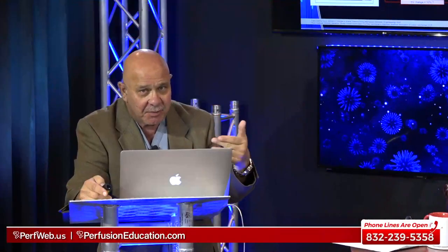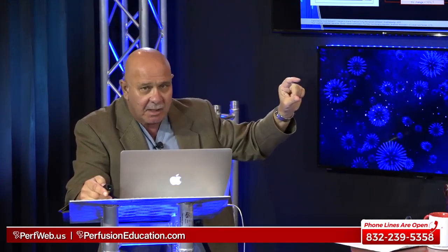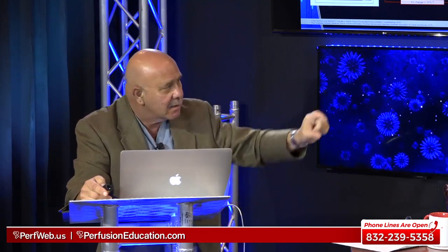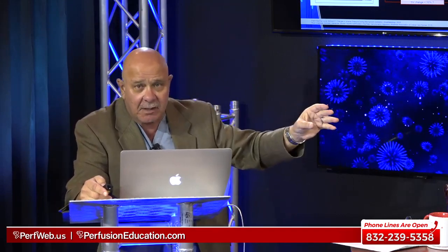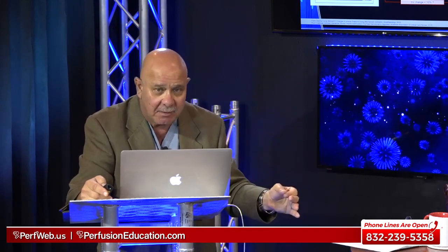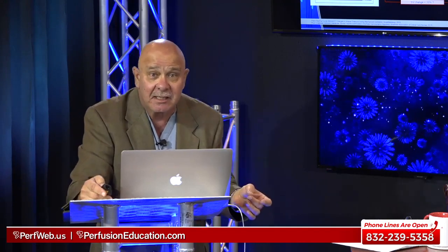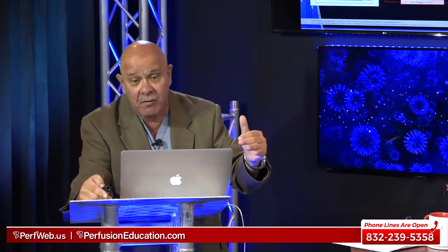This isn't for patients who are just breathing on their own. On mechanically ventilated patients, if your stroke volume variation is changing greater than 13, whatever that number means, by this monitor, then that patient needs fluid. But when it's no longer changing by that much, then your preload is perfect. Any additional fluid will not result in any improvement in cardiac output. In fact, it will probably result in you losing cardiac output, because you're going to go over the top of the Starling curve and overfill that heart.